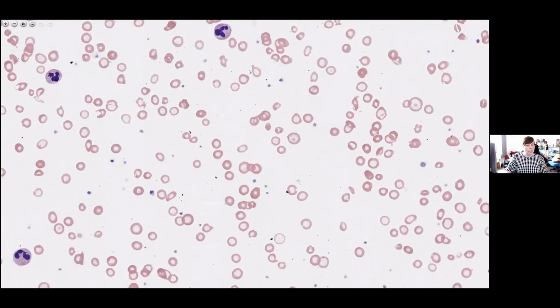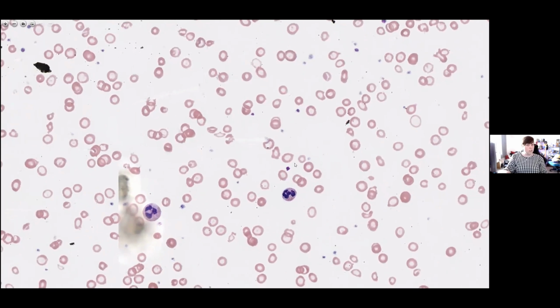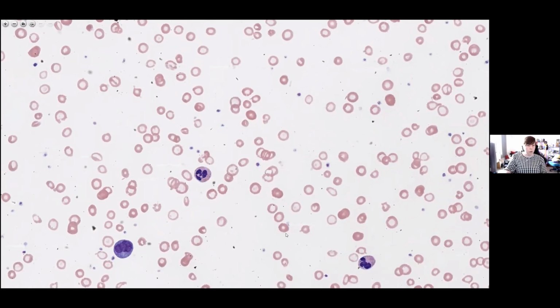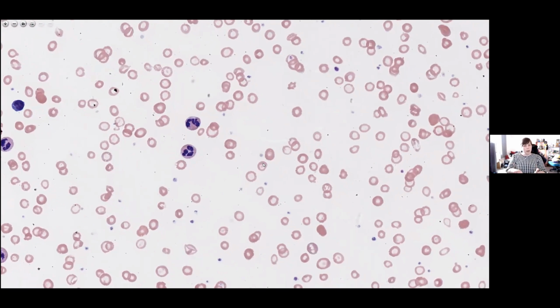Looking around at the platelet count, for my laboratory range it is high normal, but not what we would consider to be out of range. The platelets themselves look mostly normal. They're of a normal size, and I'm overall pretty happy that there's no issue in the platelets. So essentially what we have here is a hypochromic microcytic pattern. We have occasional pencil cells and maybe rare teardrop cells. Putting all of that together, my particular diagnosis for this patient would be a severe iron deficiency.